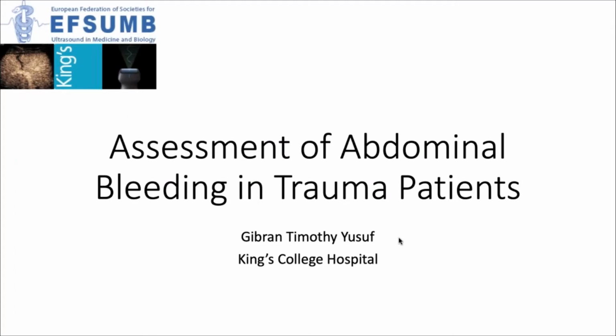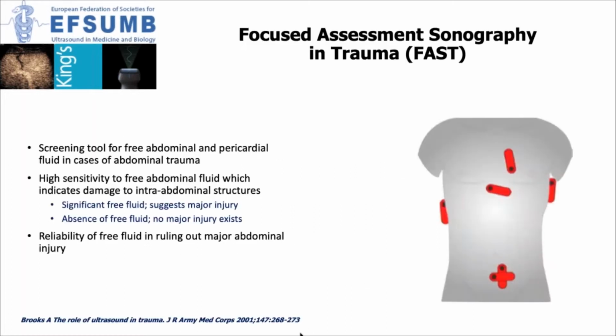So we're going to talk today about the assessment of abdominal bleeding in the trauma patient. And as Vito mentioned, we are a trauma centre here at King's, and we've got quite a lot of experience, particularly in the use of contrast-enhanced ultrasound. But really, that's not where ultrasound started in trauma.